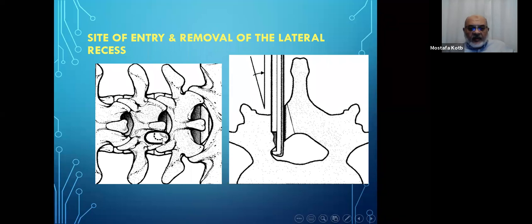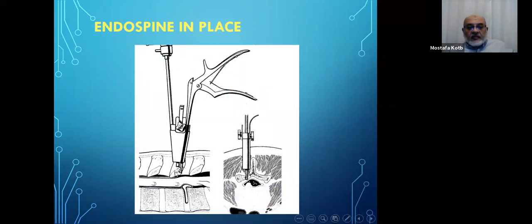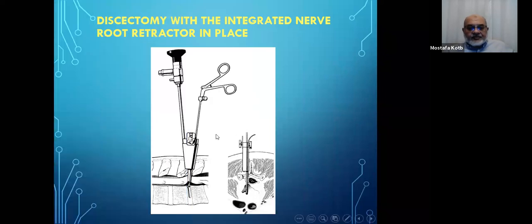You see part of the lamina and part of the ligamentum flavum. And using a Kerrison rongeur, you just take out the part of the lamina that's covering the exit of the nerve root and the prolapsed disc. During the work, you have the endoscope coming from this tube, and the Kerrison or the punch going from the other tube. There's the retractor for the nerve root. When you expose the root, you just retract it with this retractor. When you reach the disc, you can take it out piecemeal by the punches one by one.